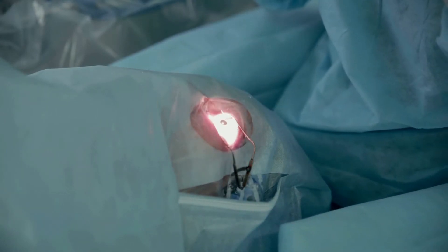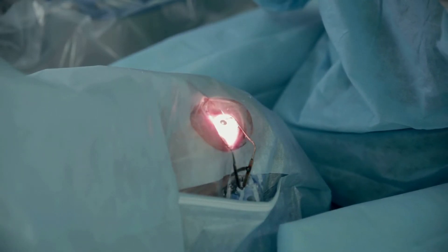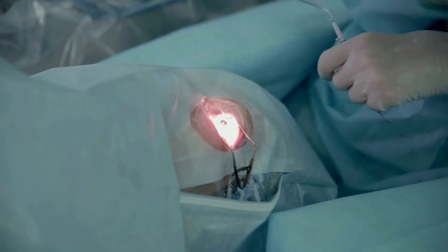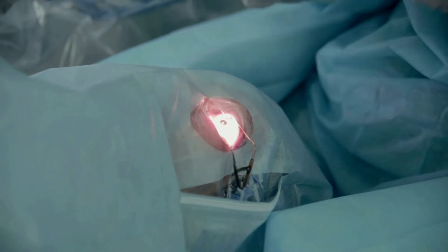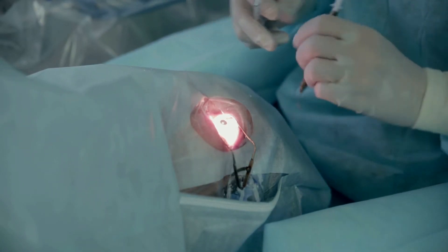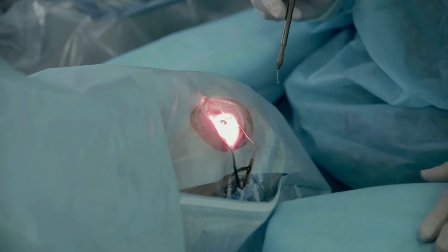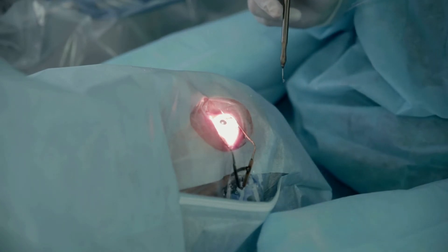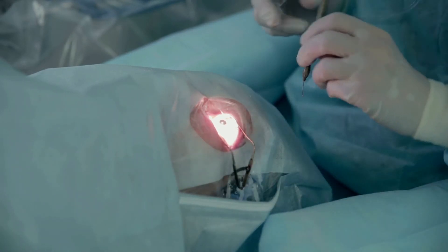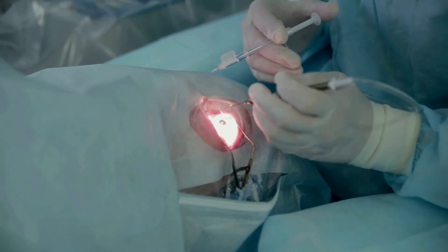These speculums have wire blades which help in retraction of eyelids without undue pressure. They allow varying the exposure of the operating field and changing pressure on the globe during surgery. The selection of speculums is often dictated by the surgeon's choice and past experience.